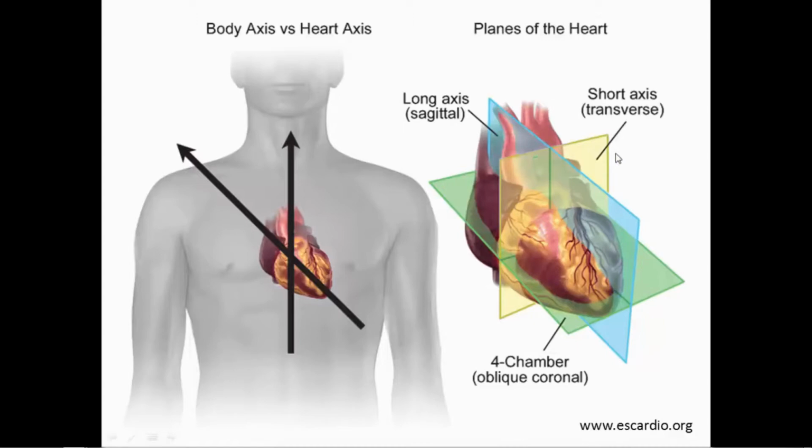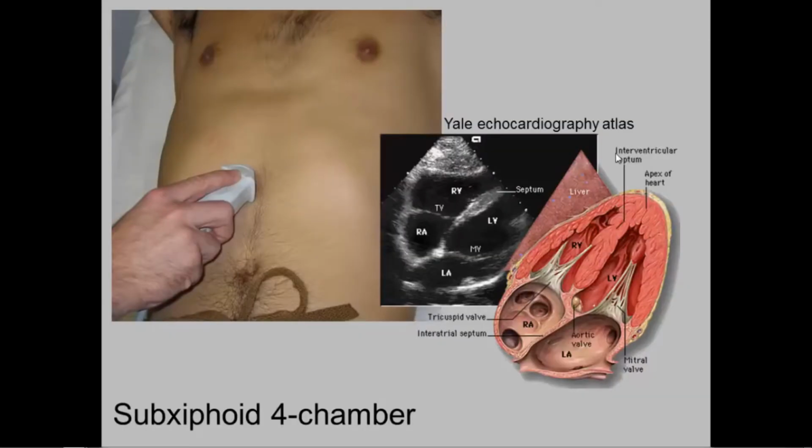This varies a little bit between ICU, emergency medicine, cardiology, and when you do a hands-on ultrasound experience, you can go over the different conventions with the instructor. So, placing the probe marker towards the patient's right-hand side and the probe itself in the subxiphoid view, we get to see this subxiphoid four-chamber view. This was the same view that we were using before to demonstrate the window.